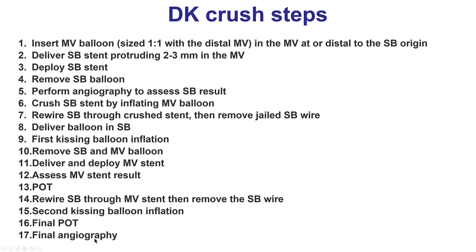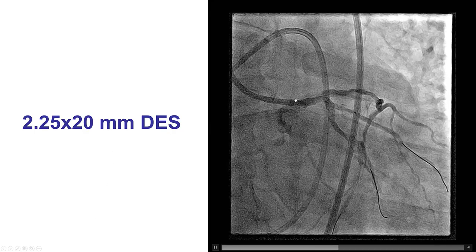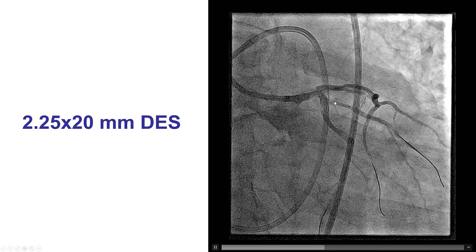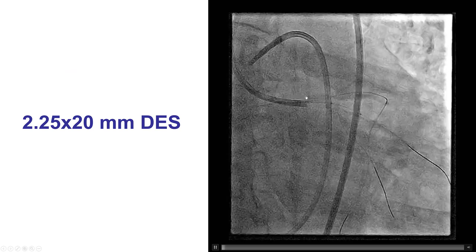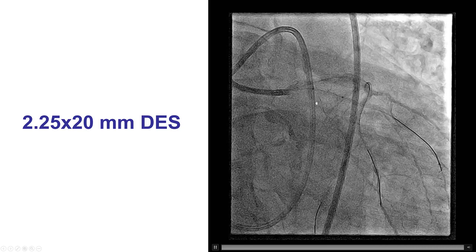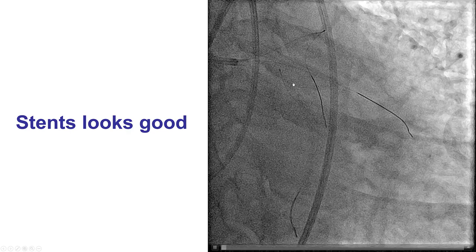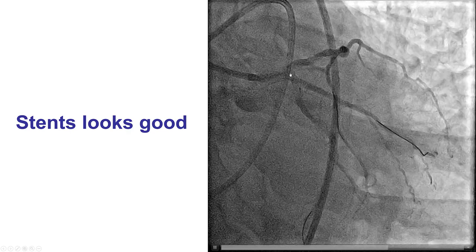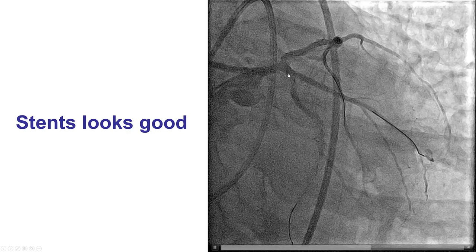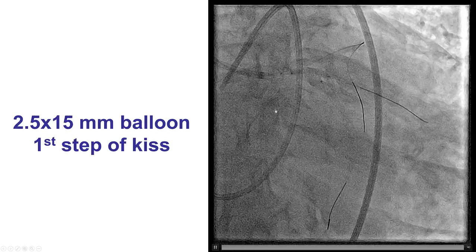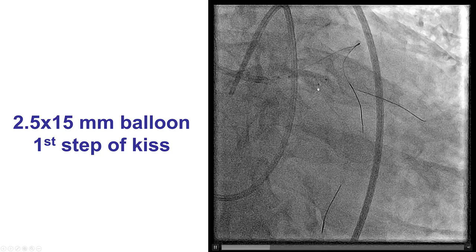These are the 17 steps of DK crush, described in separate videos. We decided to first treat the circumflex–obtuse marginal bifurcation, then the left main bifurcation. We pre-dilated and placed a stent from the obtuse marginal protruding into the circumflex. The stent was deployed and a good result was confirmed. A balloon placed from the left main into the circumflex was used to crush the stent, and then we rewired into the obtuse marginal branch and performed the first kissing balloon inflation.